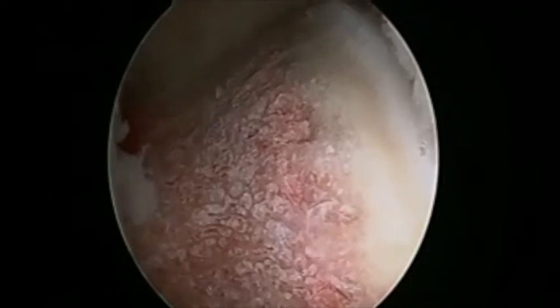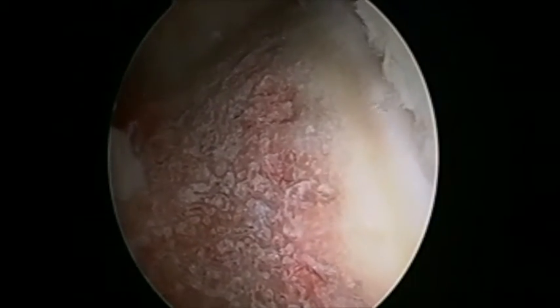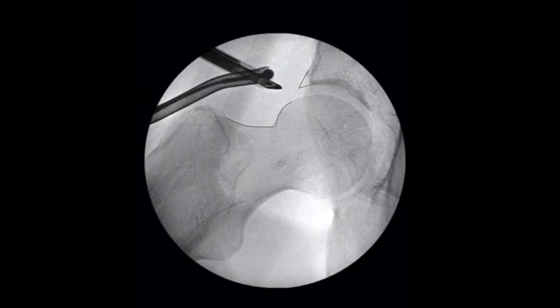Final resection of the cam is confirmed with direct visualization and fluoroscopic imaging. Not shown here, the hip is then taken through a dynamic range of motion to ensure no residual impingement occurs.